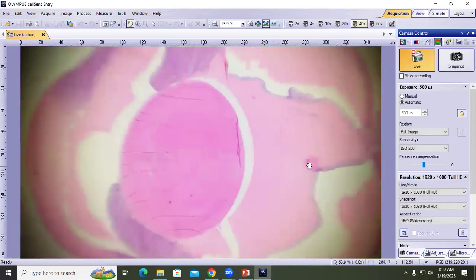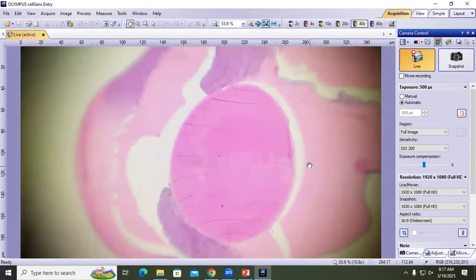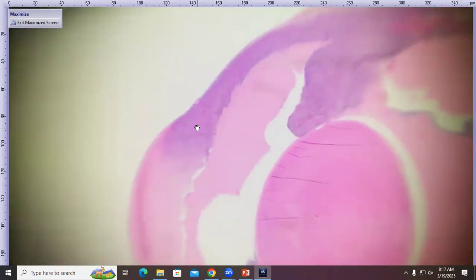Okay, so this globe is bigger than the last one because it's not phthisical, it's kind of the opposite. Cornea is to the left. It's a little bit thickened and a little bit wrinkled. What we can really appreciate is that there's a lot of basophilia, that purpleness, in the peripheral cornea, the limbal sclera, the iris here, and it trails back into the choroid a little bit. Here's our lens. At this magnification we can appreciate some fracturing of the lens nucleus. This is liquefied lens protein here, and this is still solid lens protein. So this is evidence of cataractous degeneration.